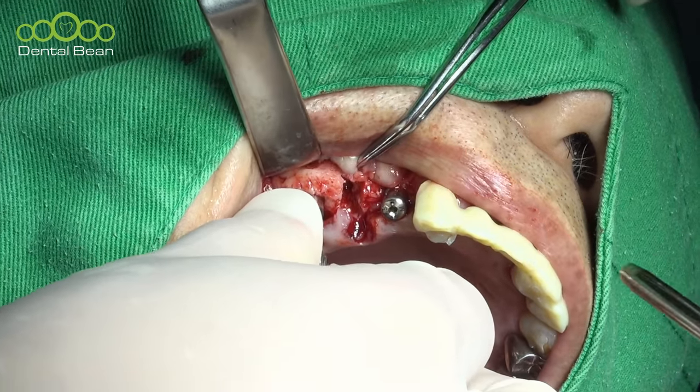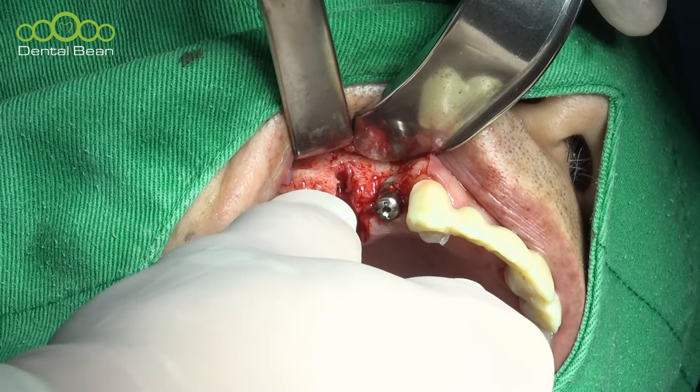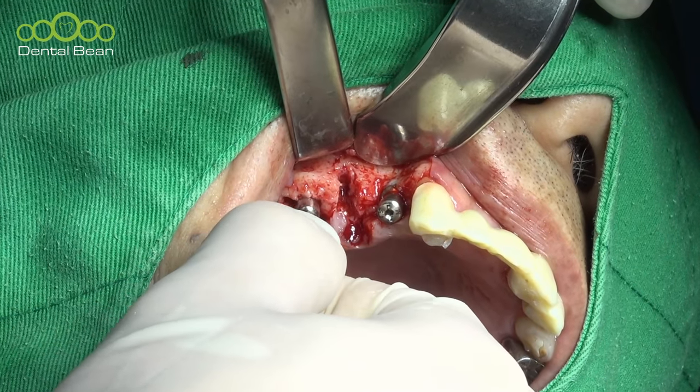Surgery above 20 Newton, initial stability above that, I like the healing cap. There are many advantages at this time.